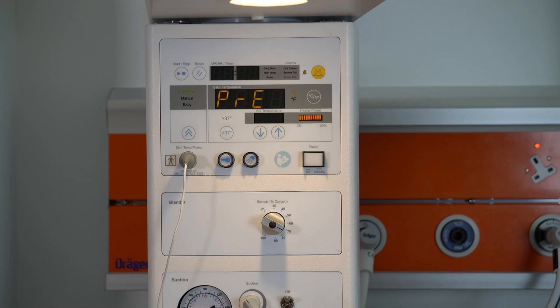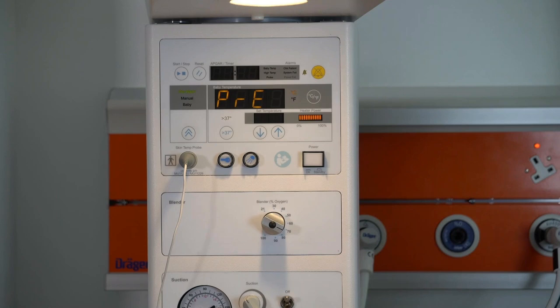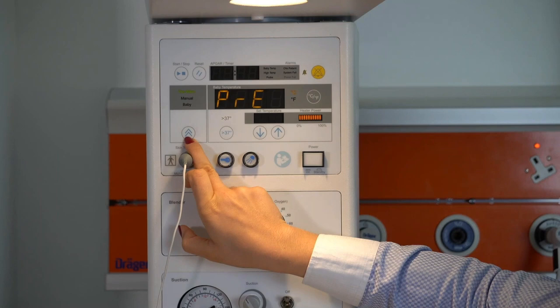So the device will stay in the pre-warming mode for 3 minutes. So we will run at 100% for 3 minutes. Then the device will automatically go to a 70% output for 12 minutes. And then after this 15 minutes, the device will be at 30%. So it will make sure that it stays warm and keeps the patient area warm. So this is to support the workflow procedure. However, of course, we can change from pre-warming to the manual operation if the baby has already been delivered. So what we can do, we can press on this arrow here and we go into the manual mode.